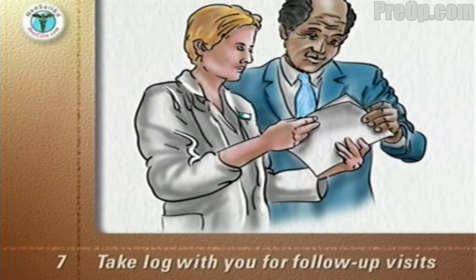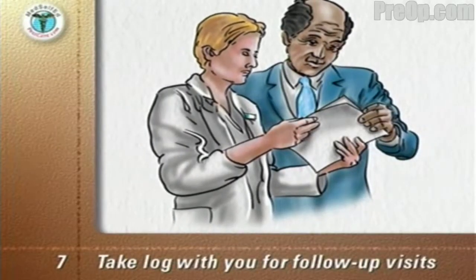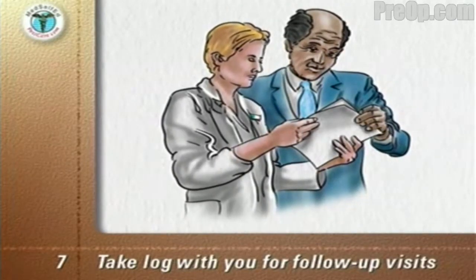Take your log with you when you return for follow-up visits to your surgical team. They will be able to monitor your progress and see when your lung function has returned to its pre-surgery value.